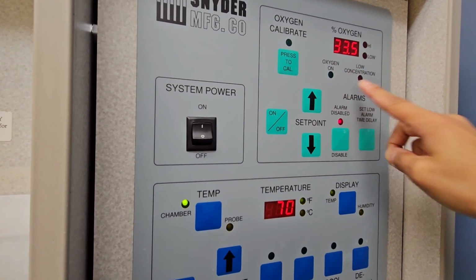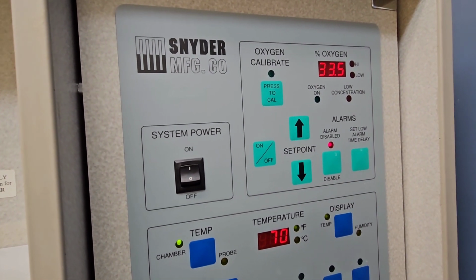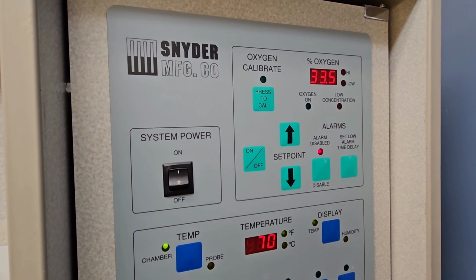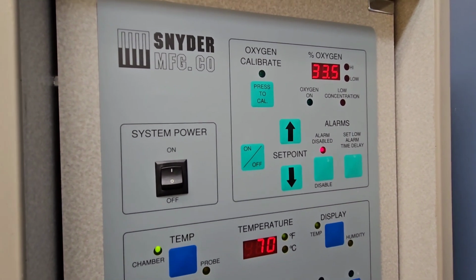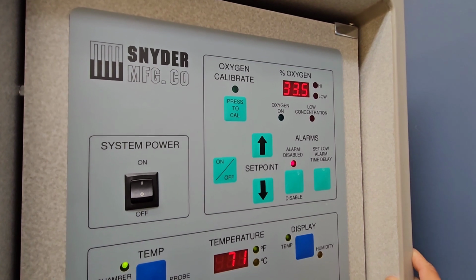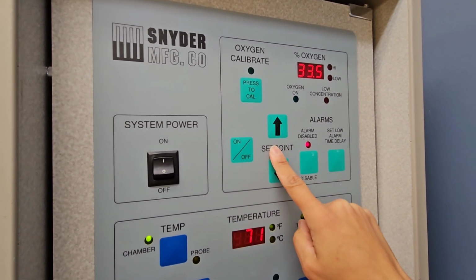So sometimes when we have patients in oxygen and they're getting better and we want to slowly wean their oxygen back down to normal air, which is 21% oxygen, we will lower their oxygen percentage by 2% every couple hours per the doctor. And to do that, I will change the setting with this set point here.